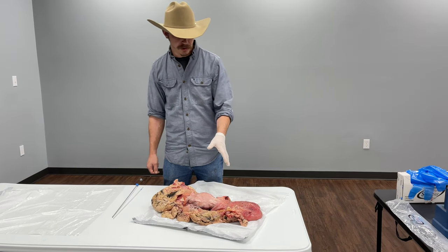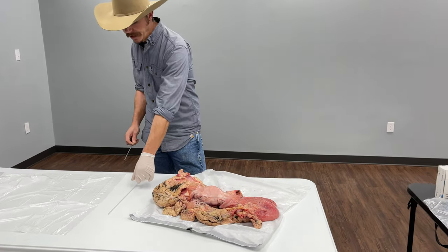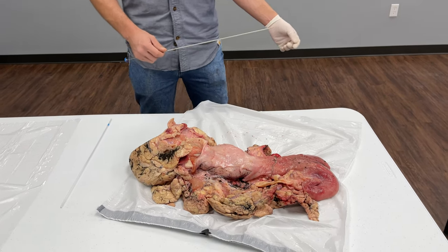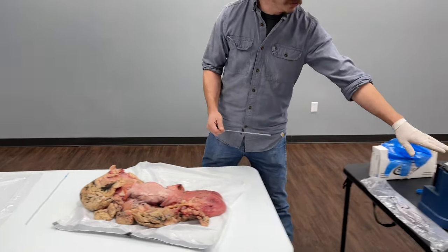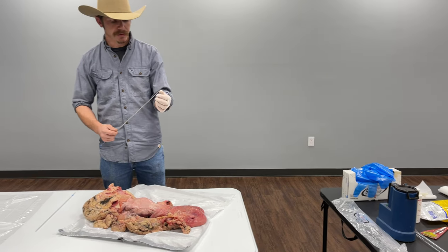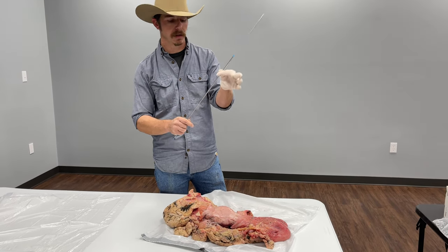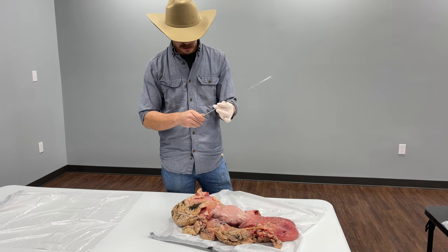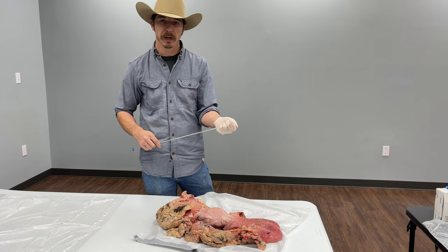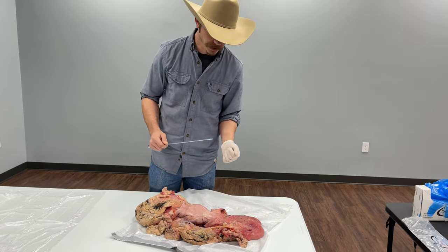Now on this reproductive tract, I'm going to demonstrate how you pass a rod to do the actual breeding part of artificial insemination. When you're out in the field breeding cows, you're going to have a tank, pull a straw out, and thaw that straw in a water bath. Once it's thawed, dry it very well and put the straw into the end of the gun. Snip the end and put your sheath onto the gun. We want to keep this warm because cold and temperature fluctuations will kill semen.